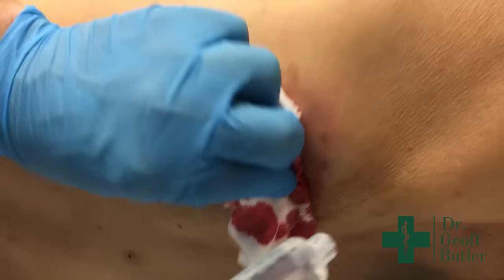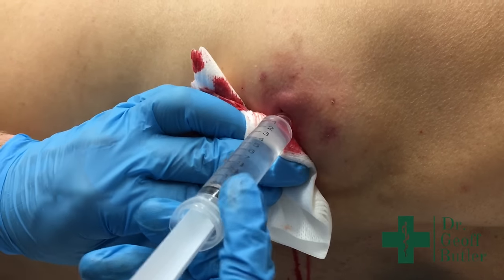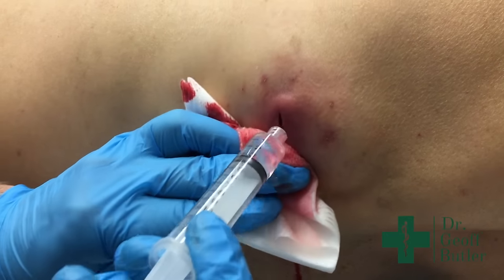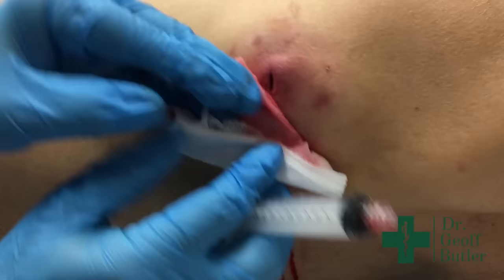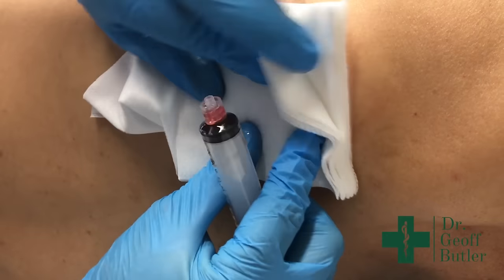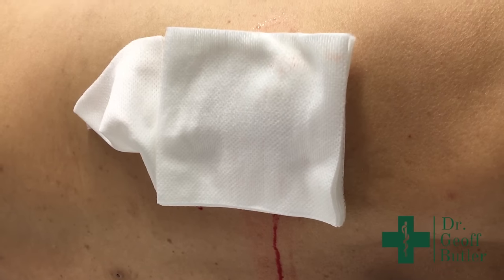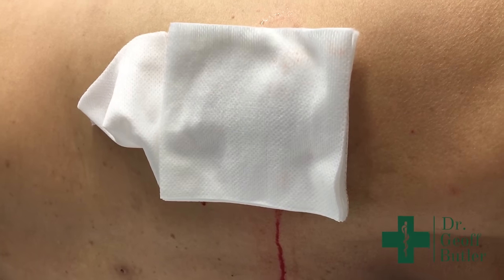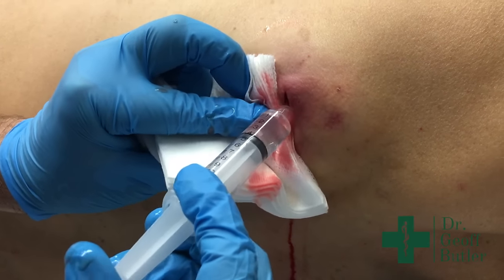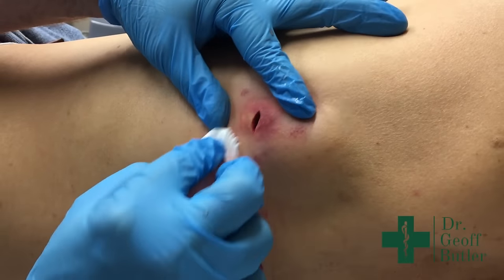So the other thing we're going to do is irrigate it. This is another debate: when do you irrigate, when do you not? For the most part you should irrigate, but if you knew you were packing, it becomes less important because this is going to be open and healing by secondary intention. Now this will be healing by secondary intention anyway, but because I'm trying to avoid packing, I certainly want to make sure we irrigate it to keep it as clean as possible. I'm just going to irrigate this a bit more. You're going to notice this could be cleaner depending on position, but lots of times in medicine I don't mind making the procedure a little bit more messy if the patient's comfortable.